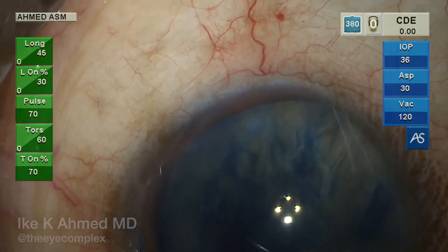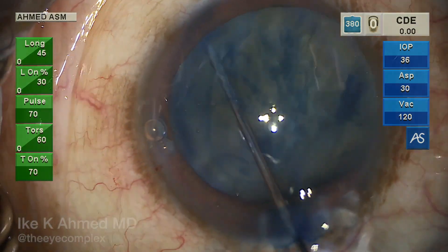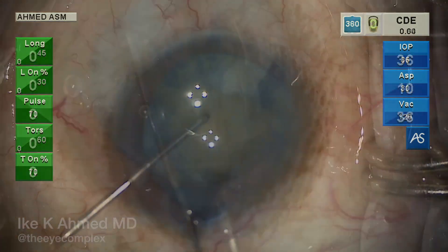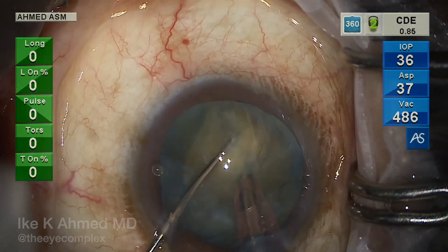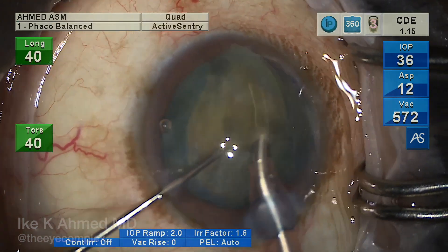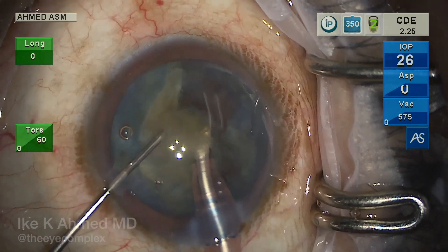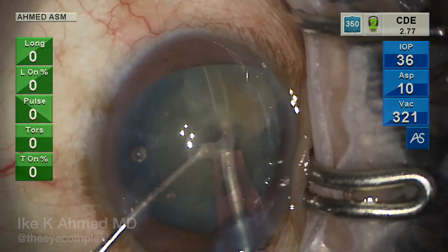The first priority is to remove the cataract successfully, facilitated with hydrodissection. Because the capsulorhexis is fairly large, this actually makes it easier to remove the dense cataract. A vertical chop technique is used — longitudinal phaco initially with a vertical chopper to create a central crack, then splitting the nucleus into two. Torsional phaco is then used to remove one hemisection in a hemiflip technique. This has become somewhat easier because of how large that capsulorhexis is. The second heminucleus is then removed.